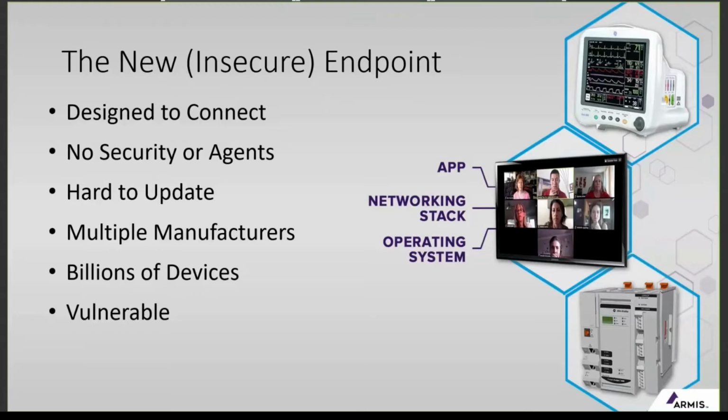Now, when you talk about the similarities between traditional IT devices and an infusion pump, patient monitor, etc., it's pretty much where the similarities begin and end. So many of these traditional IT devices have been built for decades, tweaked for decades, and enhanced over time to the point where companies like Microsoft have very rigorous processes in place to release patches every second Tuesday of every month that every company understands how to apply to their different devices, and they do so on a regular basis.